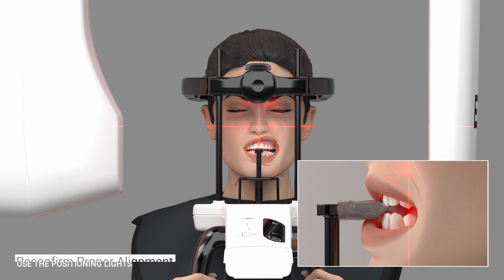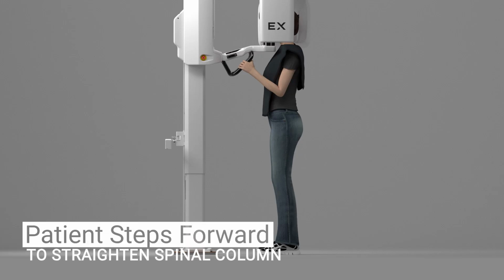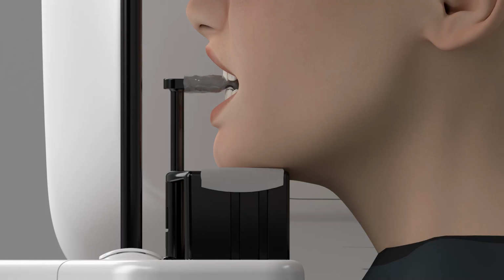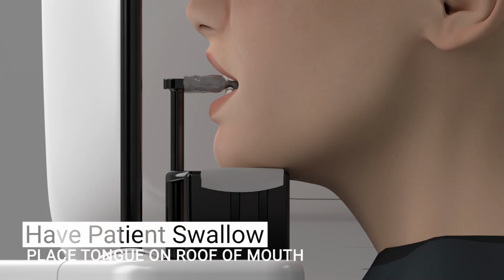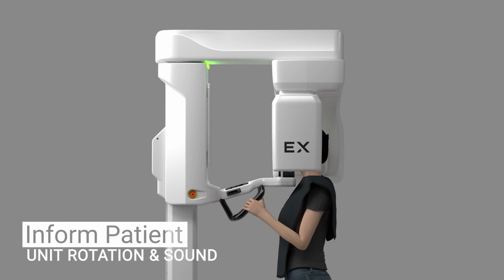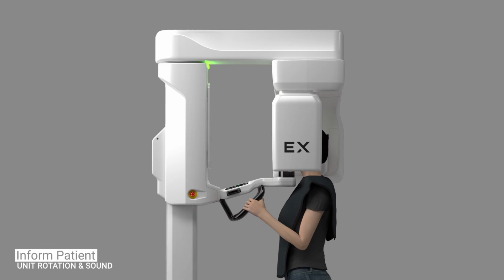Ask the patient to maintain their grasp on the patient handles and take one step forward to straighten the spinal column. The patient is now leaning slightly backwards and should remain in this position during image acquisition. Ask the patient to swallow, close their lips around the bite block and press their tongue against the palate. If possible, breathe through their nose and remain still for the duration of the exposure. Inform the patient the machine will rotate around their head and an audible sound will occur.